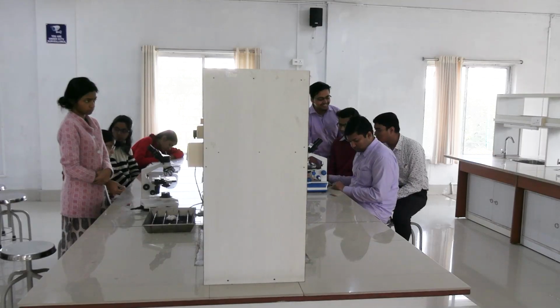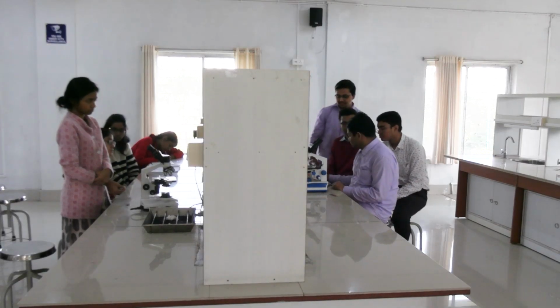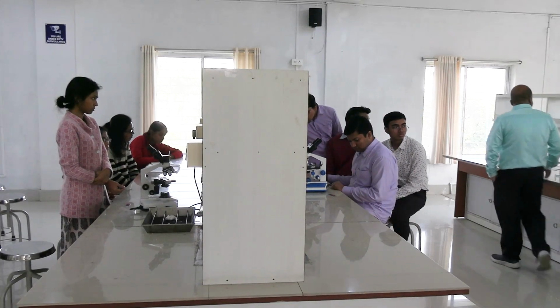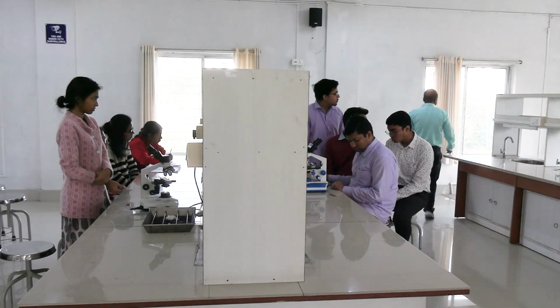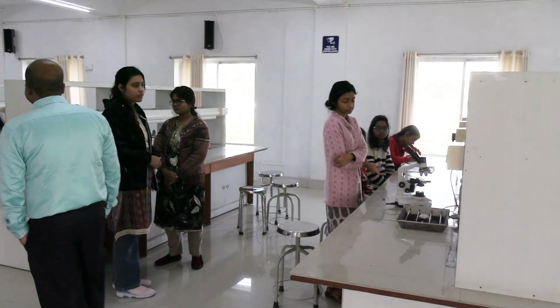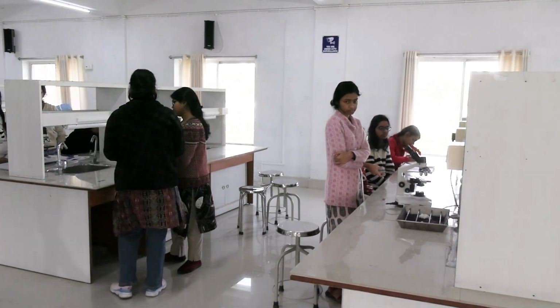So this is A positive. This is with the same blood, so it is A positive. So 2 or 3 blood samples are there. That's why I prefer taking capillary blood, and it will help you with pricking also. It has to be free flowing. Without that, you can't do experiments.